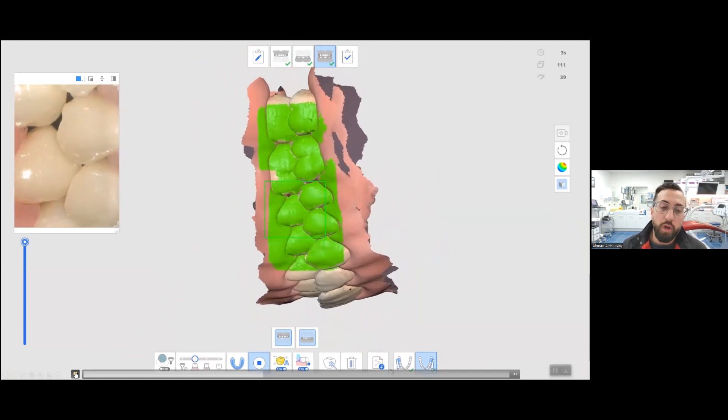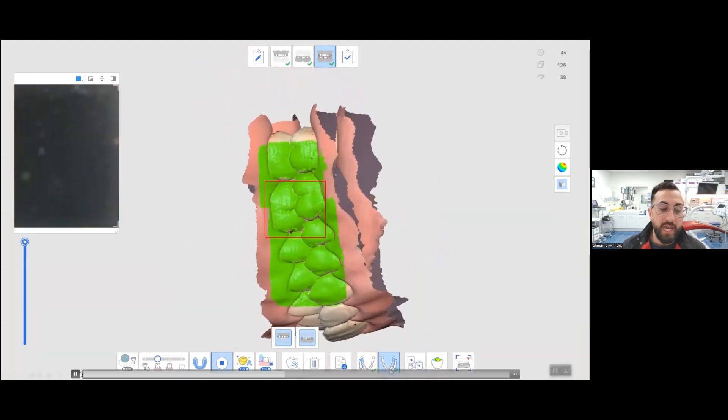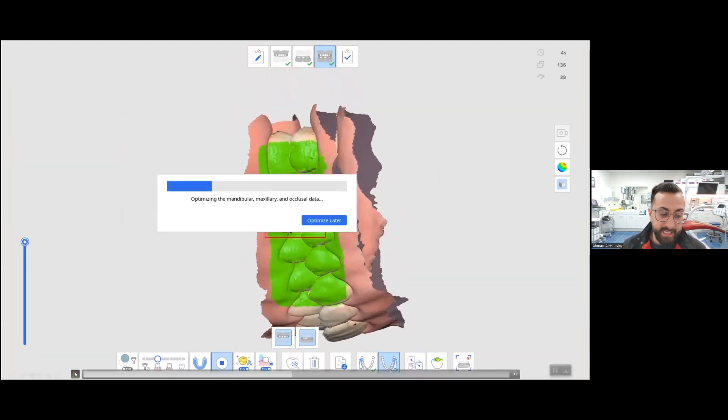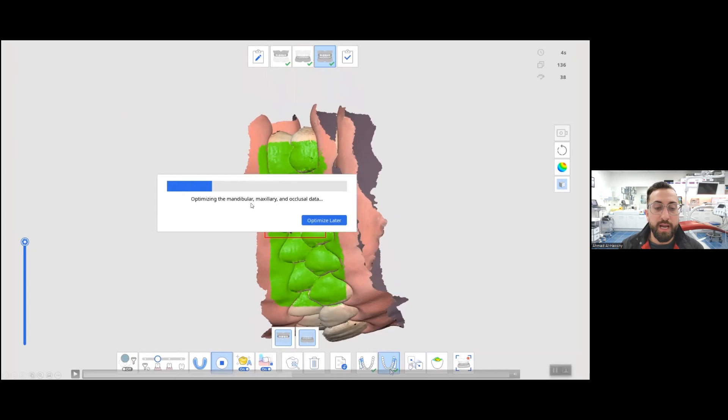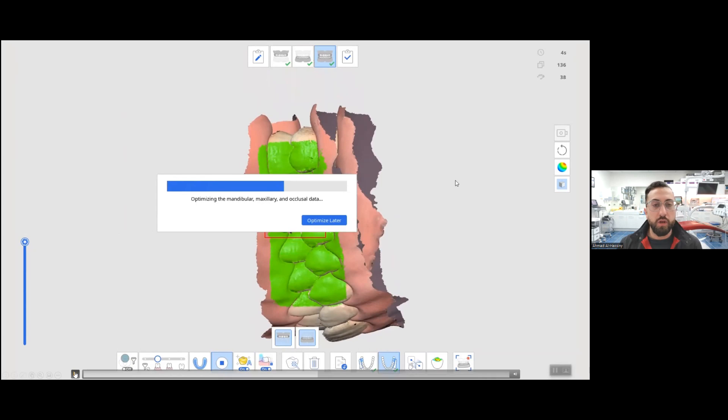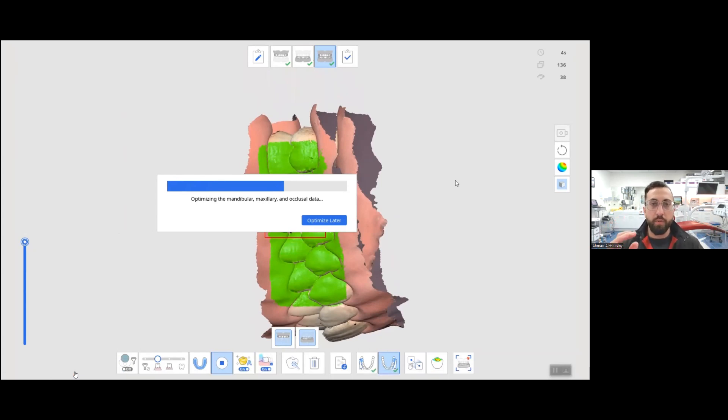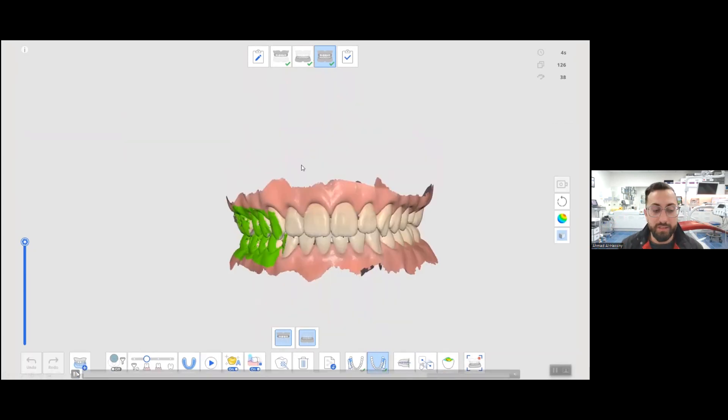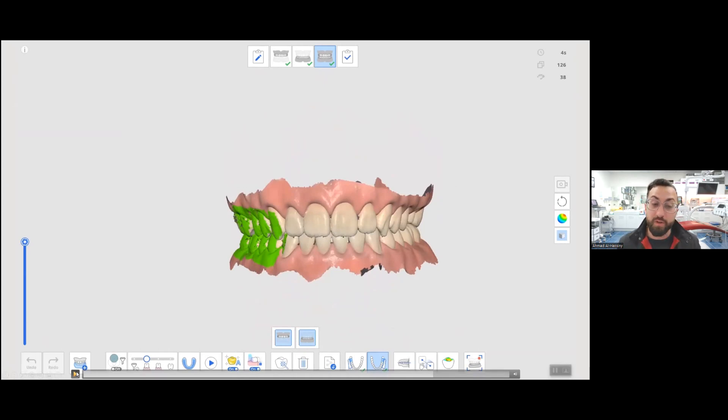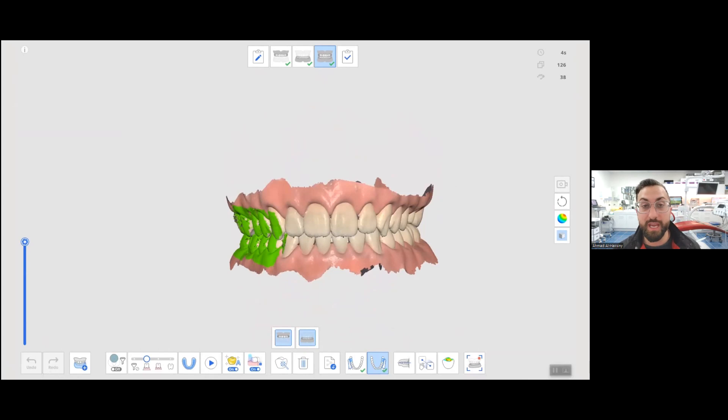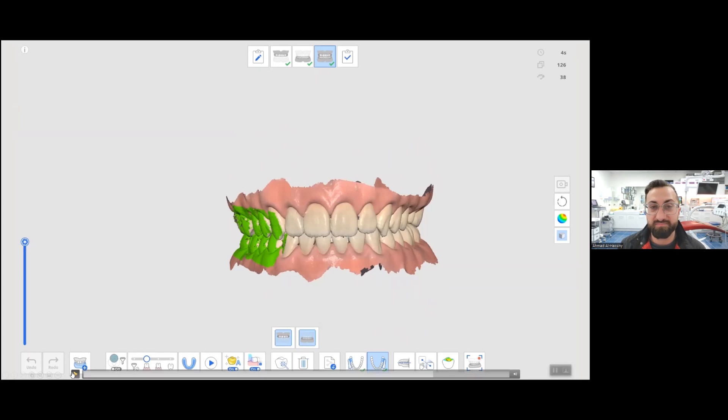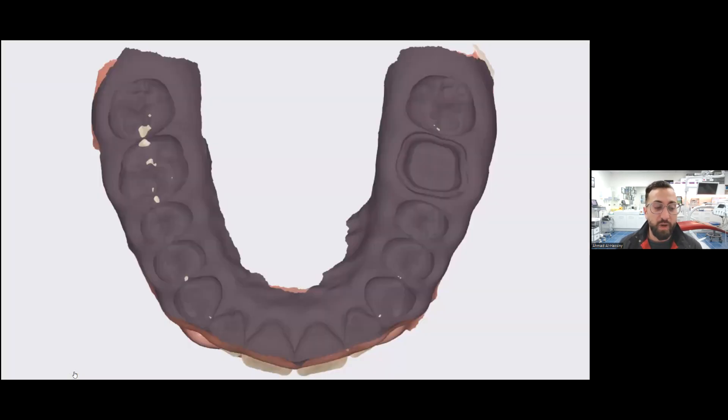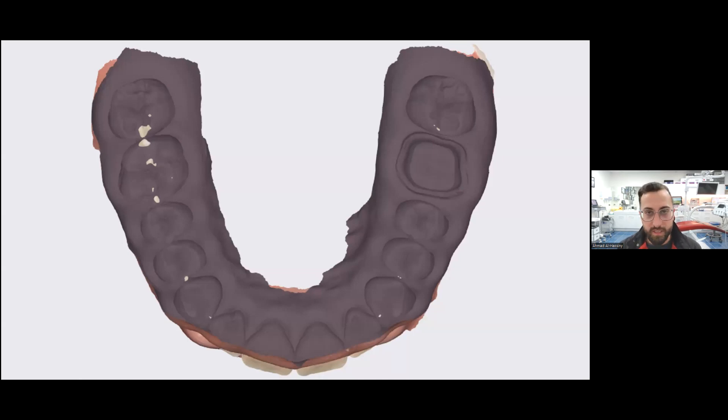And so you can go to the other side now, and retake the bite scan on the other side. What you're going to see the Medit software do when you take two bite scans, and this happens automatically, is that it says optimizing mandibular maxillary and occlusal data. And what this software is doing is just looking at these two bite scans and ensuring the perfect bite. Pretty easy fix in my point of view - if you're getting a lot of intersections, you should probably be taking full arch scans in the first place. And if you've taken a full arch scan, a bite scan only takes five to ten seconds, there's really no excuse not to take two bite scans on each side.